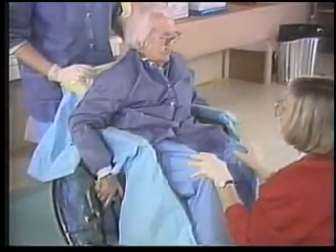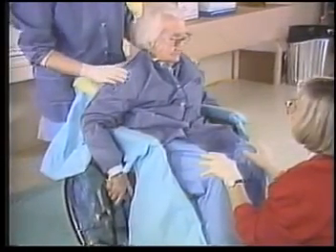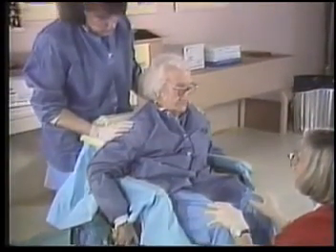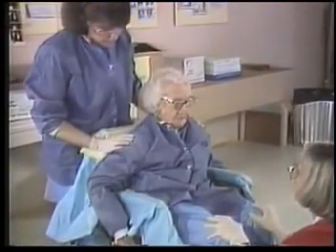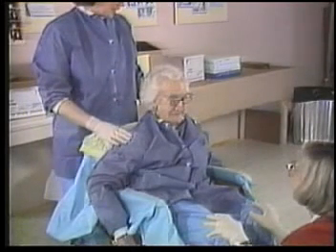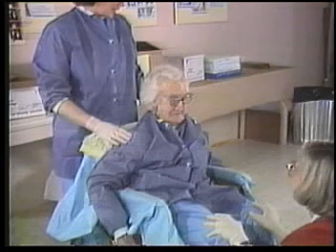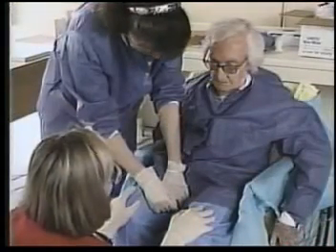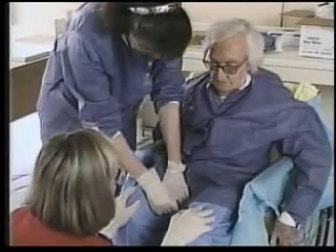While one person monitors the bag, the therapist is to be concerned with the positioning of the client. Remember, when the molding bag is filled with the liquids, it's quite slippery. The client will need to be gently held in place by their knees and/or pelvis. This is essential to prevent sliding, as well as to achieve proper positioning. This will also allow you to separate the legs to create a larger pommel area if needed.